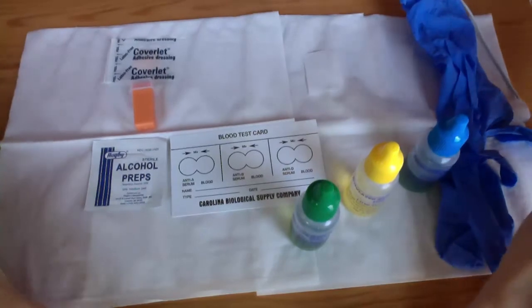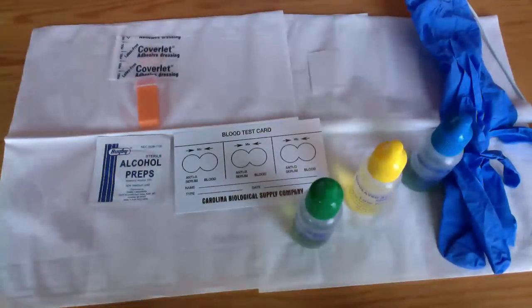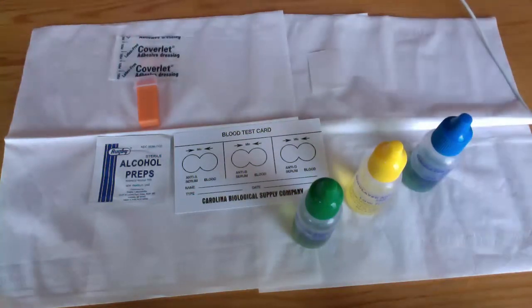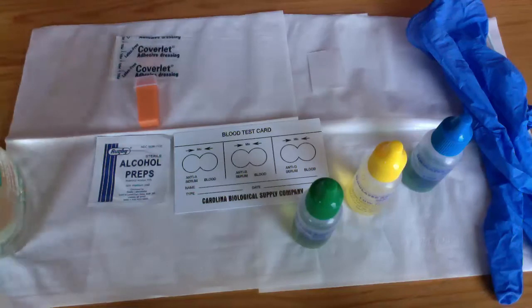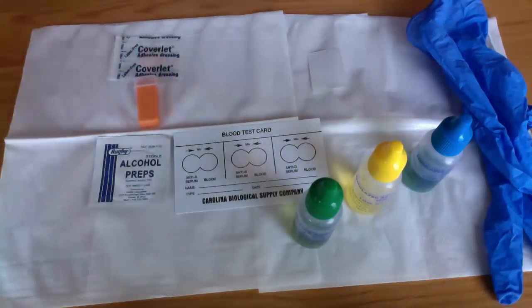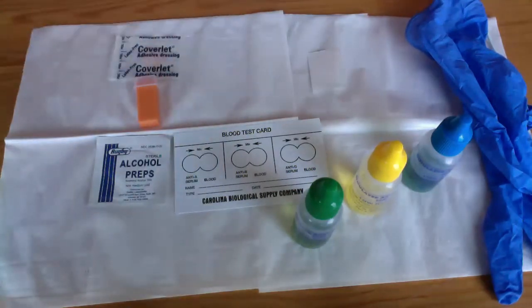Okay, so here we are going to do the blood typing portion of the lab. Eventually, hopefully, we will have kits to send out. So I'm going to go through the lab just as if you were to have a kit at home. You want to set everything out first on a piece of paper towel or something, especially on a clean surface. I have some good old hand sanitizer here, so you want to sanitize your hands and clean them up beforehand.